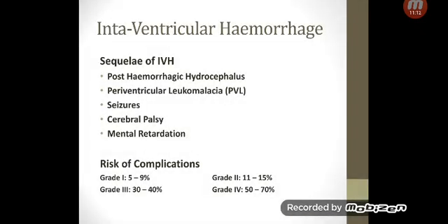Okay, so now you know that you've got IVH. You can just say there's hemorrhage, right? Why is it really important to know what grade it is? Well, first of all, if you've got an IVH, it's important to pick it up early, because when you're briefing the family afterwards, you need to know what you're worried about.